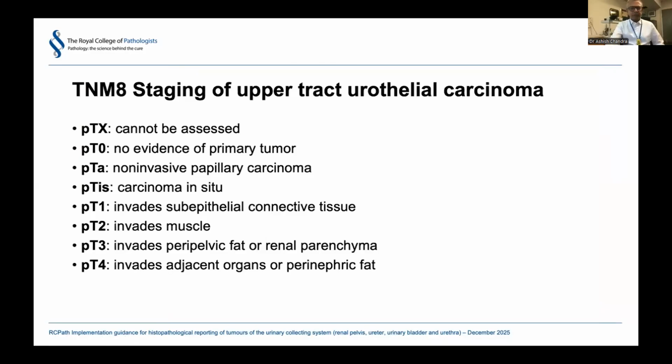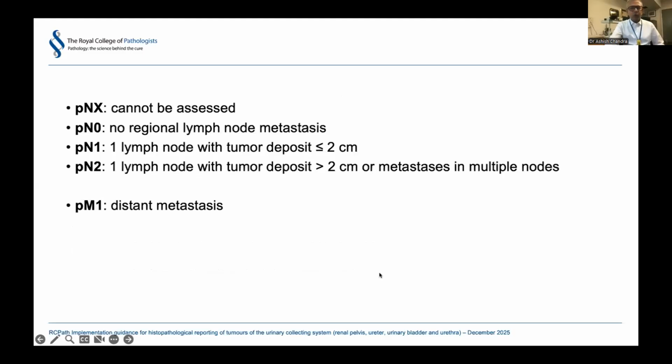Of course, you should now be using TNM8 for some time now. This is one of the revisions in this particular guideline from the last time that this was written, when we were still using TNM7. So that is one of the changes to this document. And of course, you have to be able to answer all the points that are included in the staging system in your report. And if any lymph nodes are submitted, also remember to offer a lymph node stage.